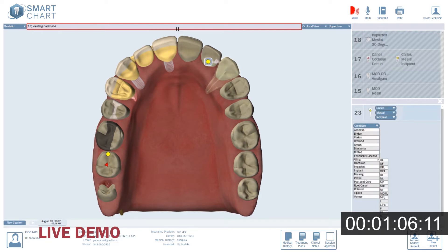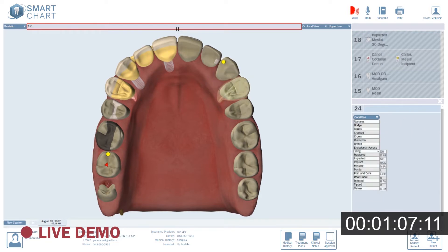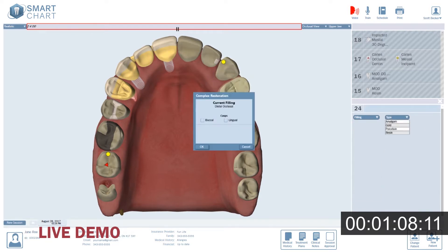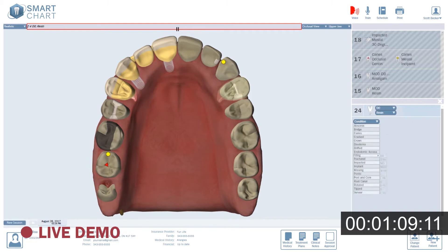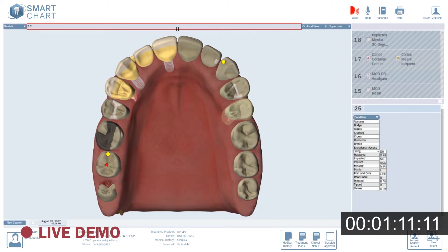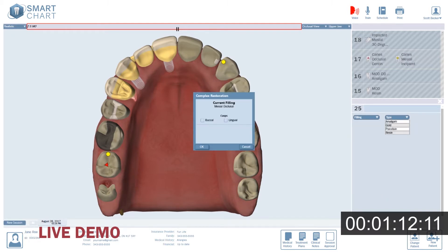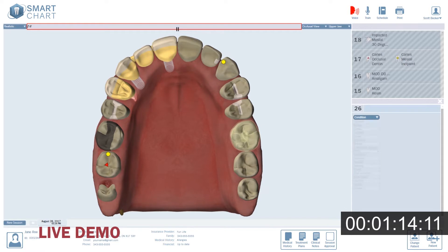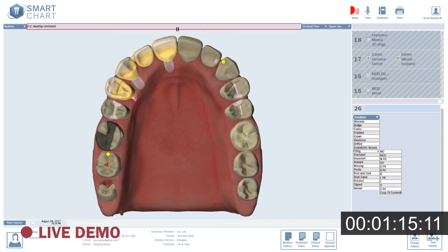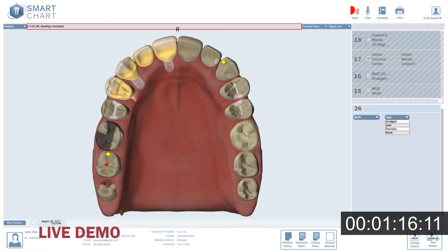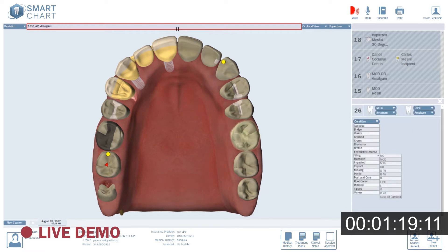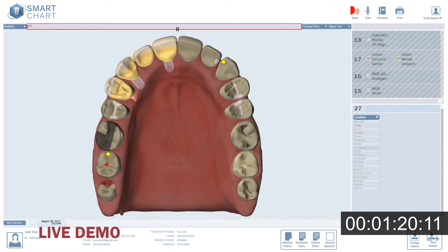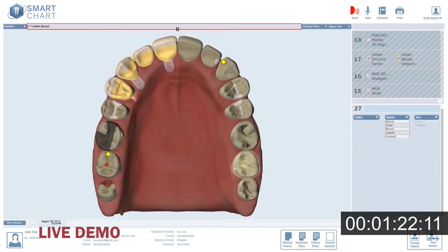2.4: DO, resin. 2.5: MO, resin. 2.6: Mesial pit, amalgam, distal pit, amalgam. 2.7: Caries, buccal, dentin.